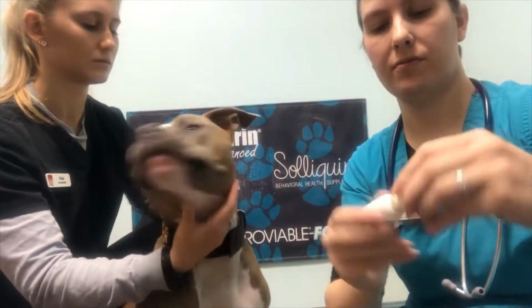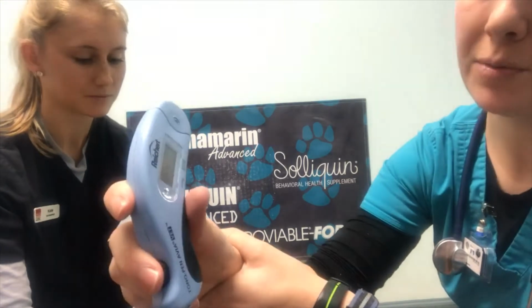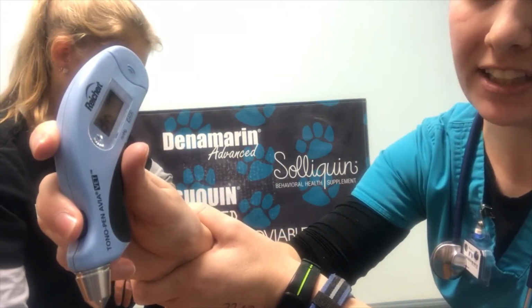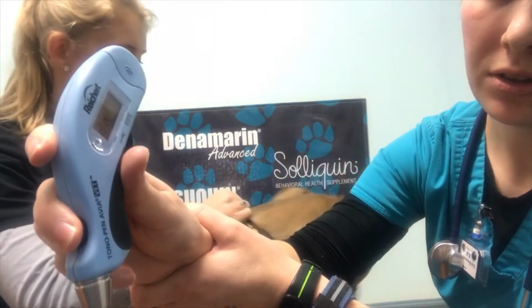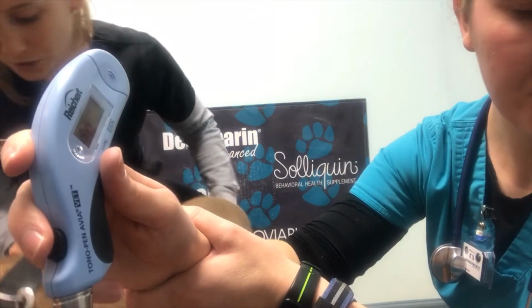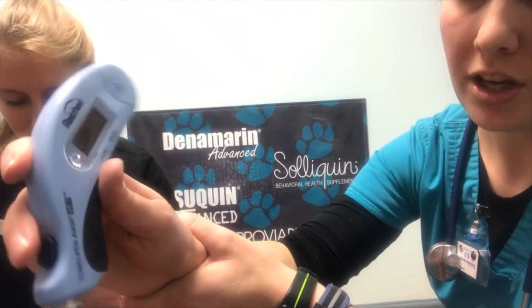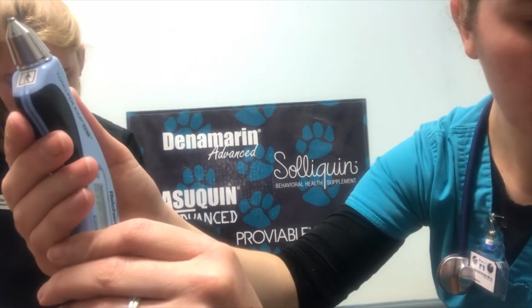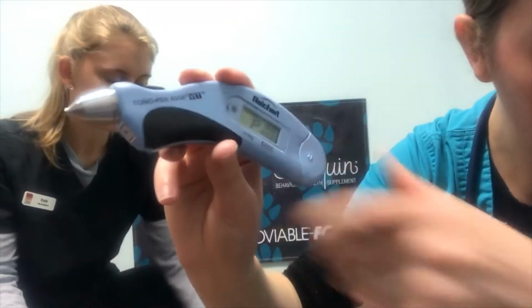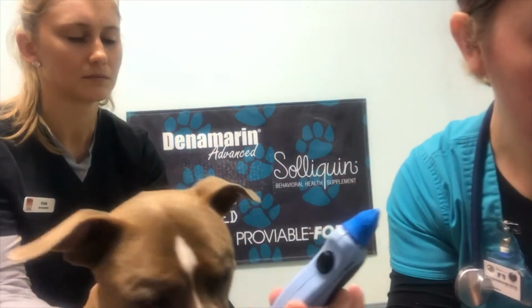I'm going to calibrate my TonoPen first off. So I'm going to hold it. Press and hold the activation button for 5 seconds, at which point it should have it upside down. So I'm going to watch that, and it should say that about 15 seconds it should have that up with a beep. So now it does. I'll hold it straight up, and so that time it passed. So now this is ready to go. You always want to make sure you change that out for each patient.